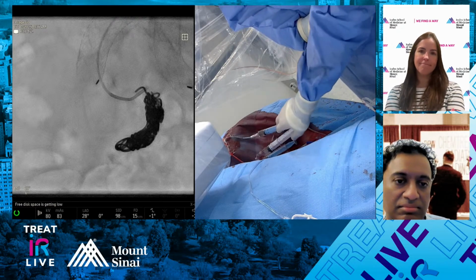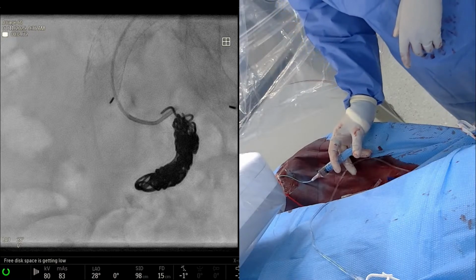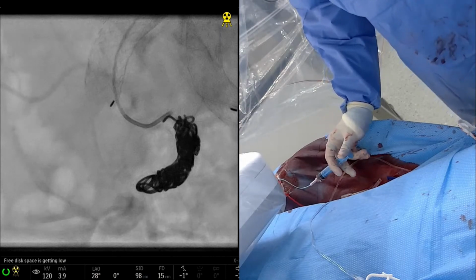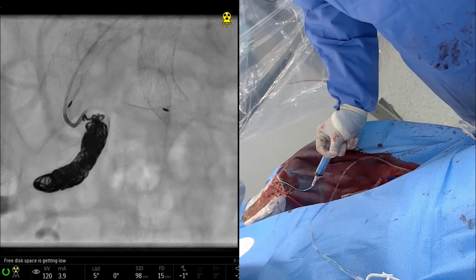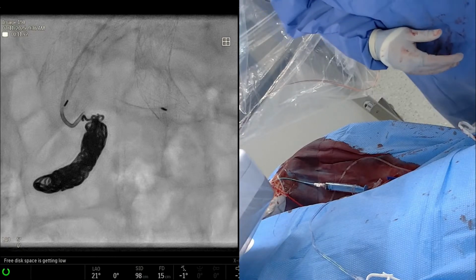So that one packed really well. You do have to be careful, especially with the packing coils, because they're really soft. As you drag your diagnostic catheter back, you don't want to drag your coil pack back. One thing I sometimes do is put the Benson wire in, and then pull back the base catheter so that it can't happen. You're right. I've pulled coils in a distal aneurysm sometimes, but it's so tight.